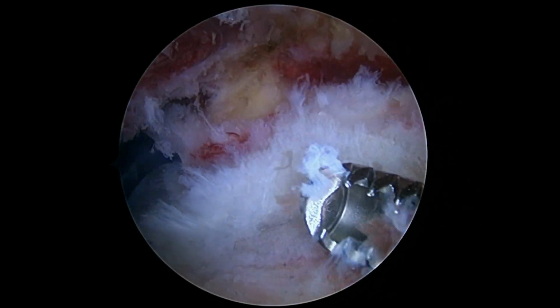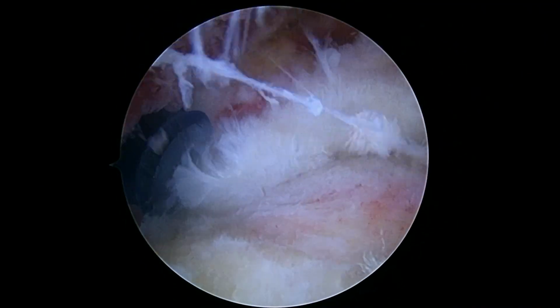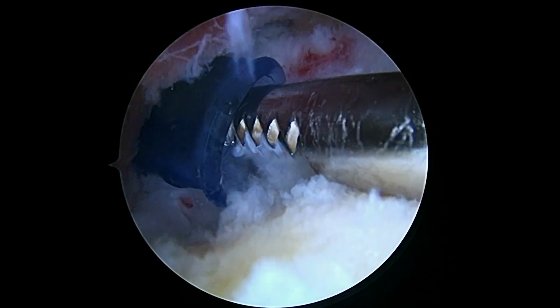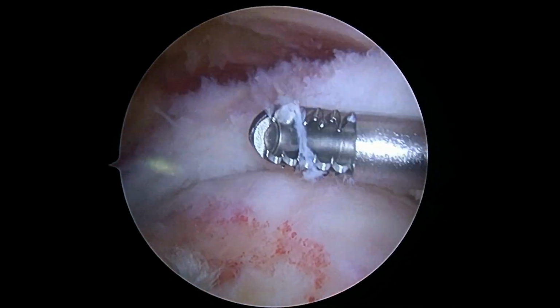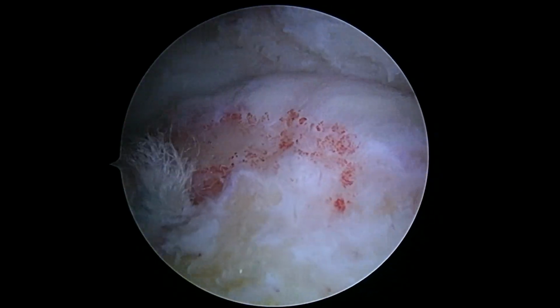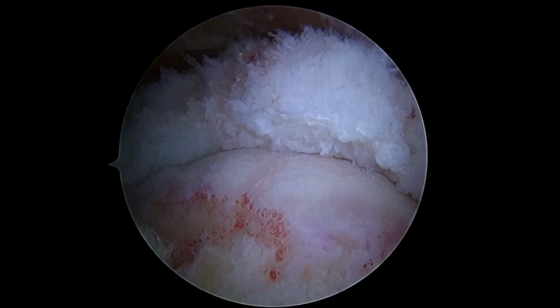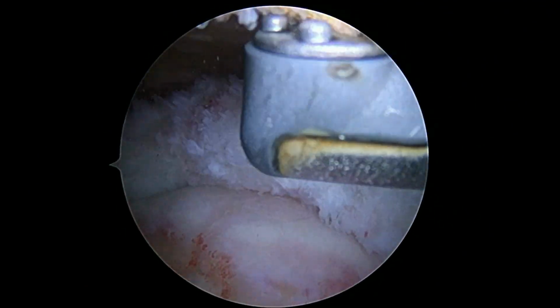Now, this is the rotator cuff tear, and it's a very large tear, or re-tear, however you'd want to look at it. And this is the front up here. Here's the articular surface. This is all torn tendon all the way to the back here. So we're going to put in at least 2 anchors. Each anchor has 3 sutures. And so we've got our work cut out for us. This is a very large tear like we talked about in the office. So we're going to get to work. We'll give you kind of an interval update in just a little bit.